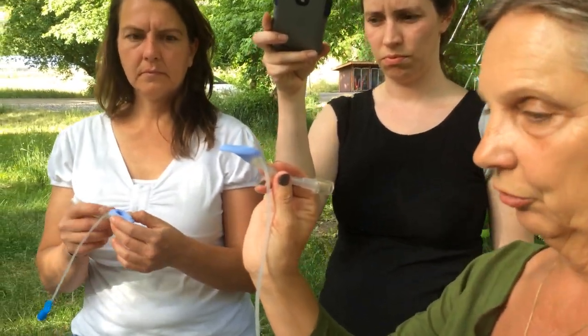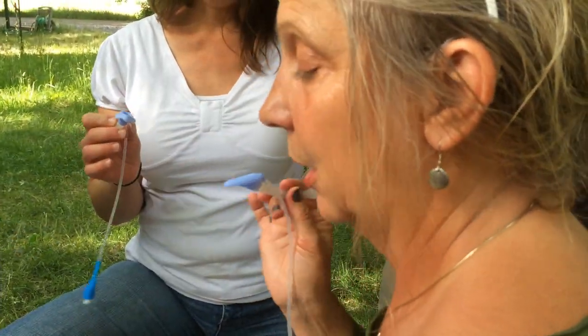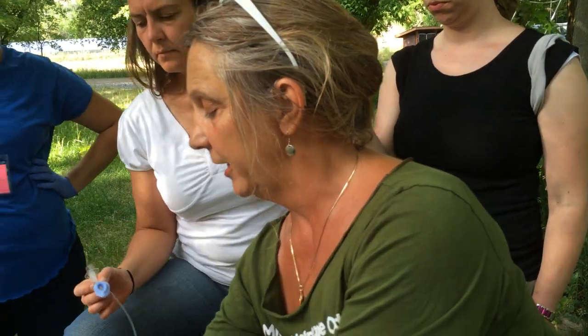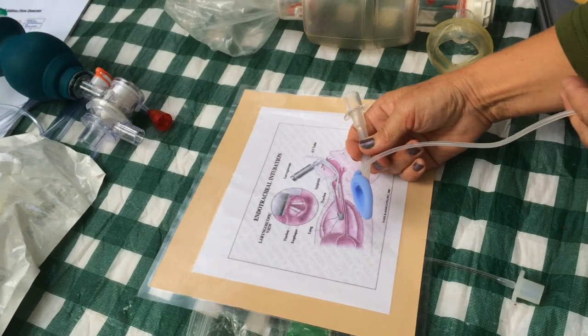Someone took my picture. Could I have my picture back? Thank you. So, when you're holding it like a pencil, it's in the way, the shape that it should go into the baby's airway.